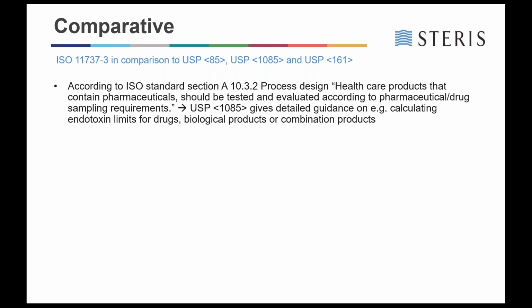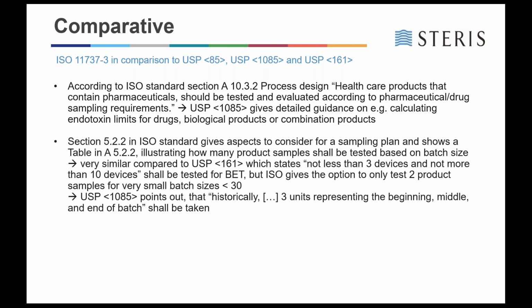So let's say a combination of a drug and a device. And yeah, another aspect that the ISO standard is considering is with respect to a suitable sampling plan. And this is nicely illustrated in a table in the annex of the ISO standard.